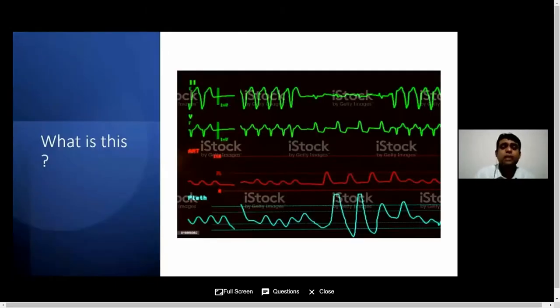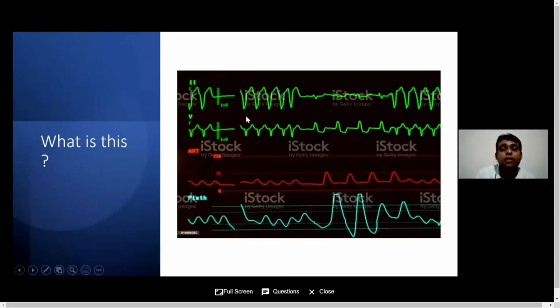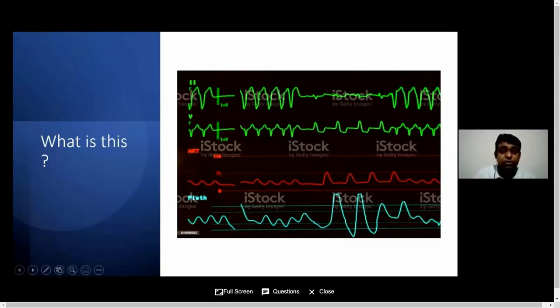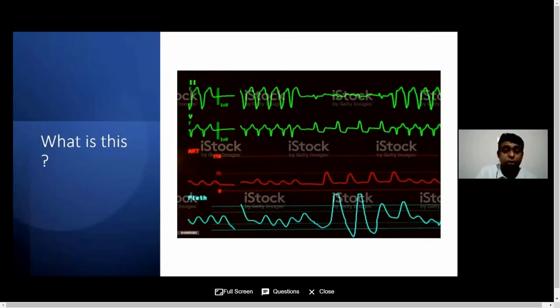Look at this patient — this patient has developed non-sustained ventricular tachycardia. Look at the pulse waveform: there is hardly any pulse. These are abnormal findings. The patient may not be having symptoms because this is a very brief event, but the next time the patient might develop a prolonged arrhythmia. You need to alert your doctor to have a look and do something about this.